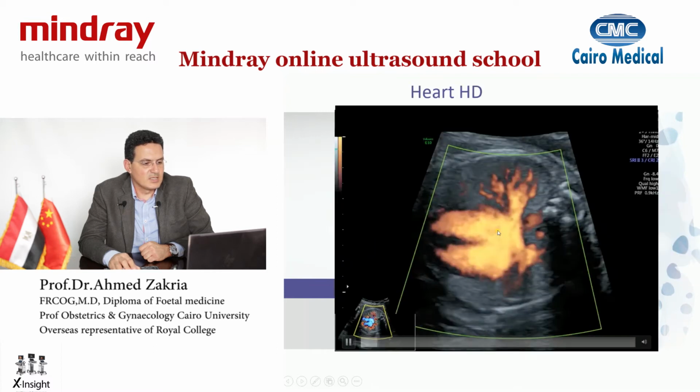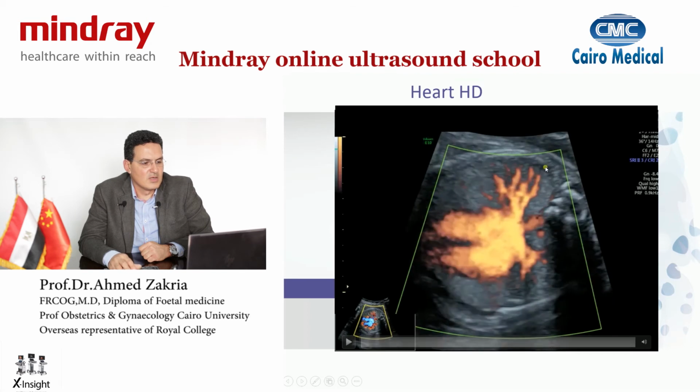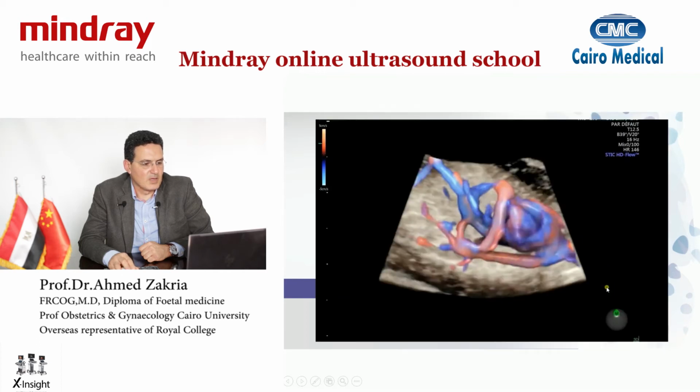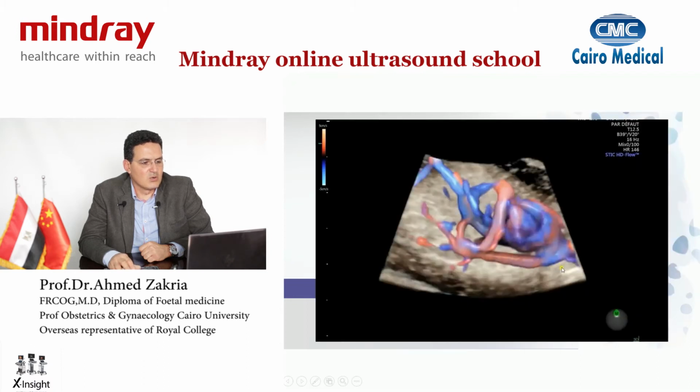Here you can actually see it in color Doppler as live. So you can see here on the left side, you can see the branches of the pulmonary vessels as they're going in, and you can see the vena cavas as they're going up into the right side. Again, you can see the different branches of the vessels as they go out of the heart and divide across the abdomen, and you can see the ductus venosus quite clearly in a thicker slice.